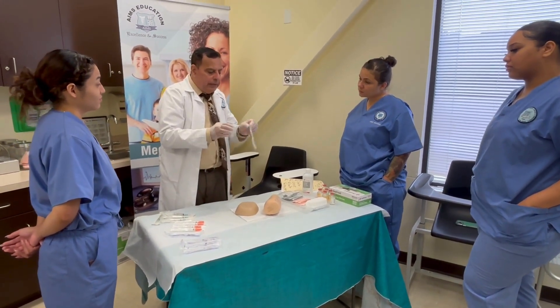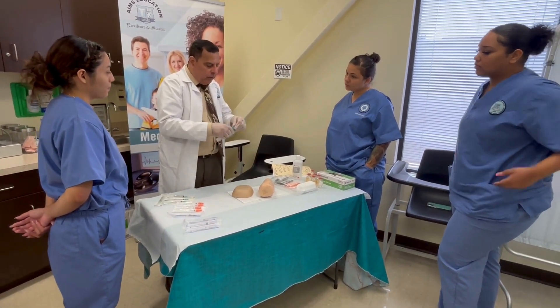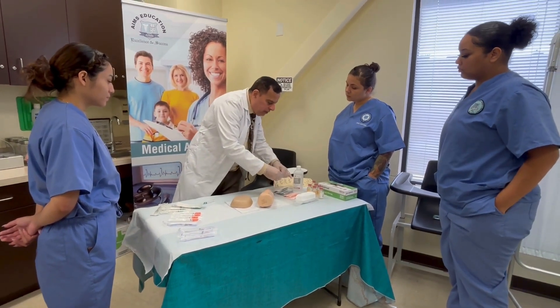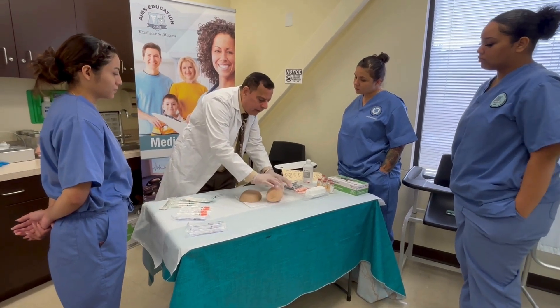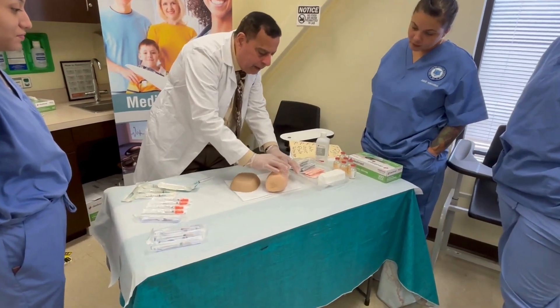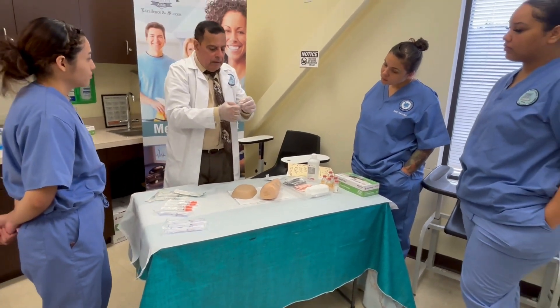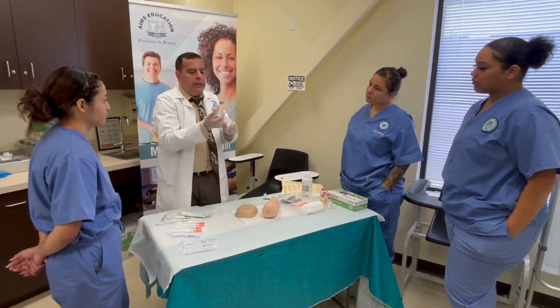Next, check the right technique — in this case it is intramuscular. I'm going to show you how to put the medicine inside the syringe using the intramuscular needle. First, I have to clean the site using a circular motion, starting from the center and making circles bigger and bigger. By the time I'm done, it will be dry and I can draw up the medicine.